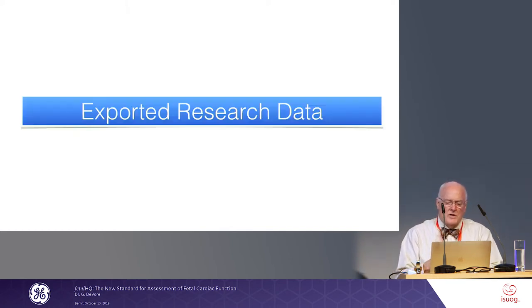However, when we saw this, we asked the question, what else can we measure besides what the system gives us? Because these measurements I just showed you are really derived for the adult population, because the software is from an adult cardiac protocol. So going back and talking with the engineers, I showed you that graph a few moments ago of those 49 dots. I said, I want more information. So here's what we did.